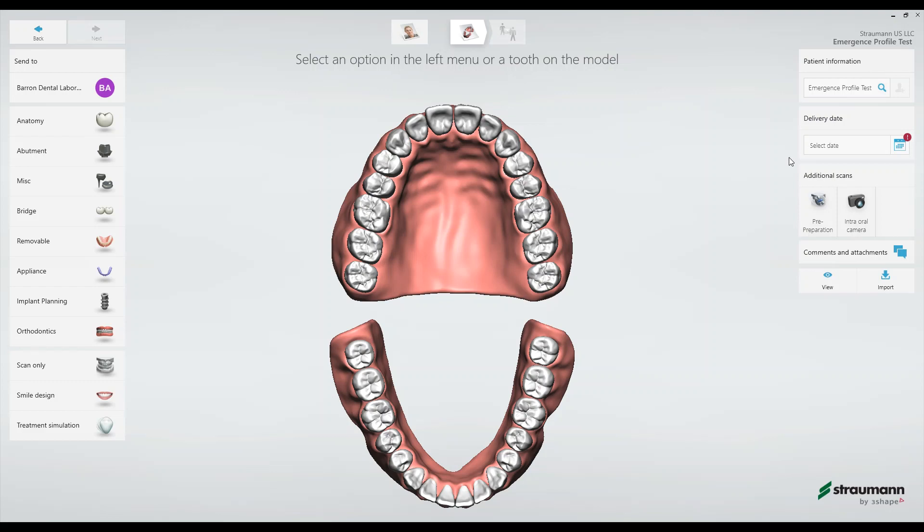Moreover, this minimizes the clinician's time in scanning by allowing the dental assistant to take the preoperative impressions. It is important to check your local guidelines on permitted duties for dental assistance as they do vary state by state.